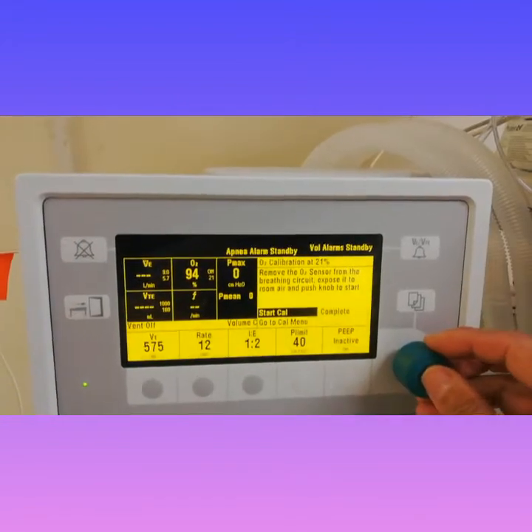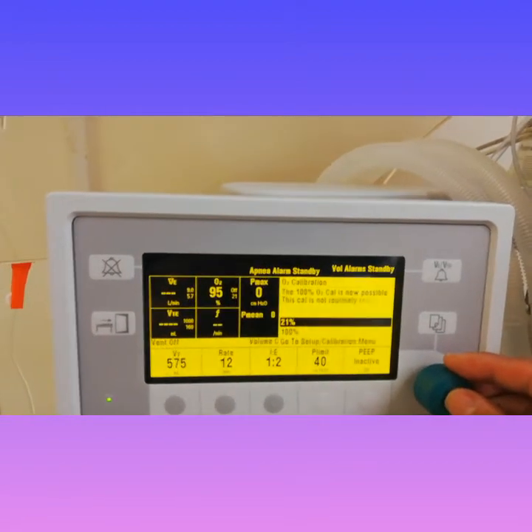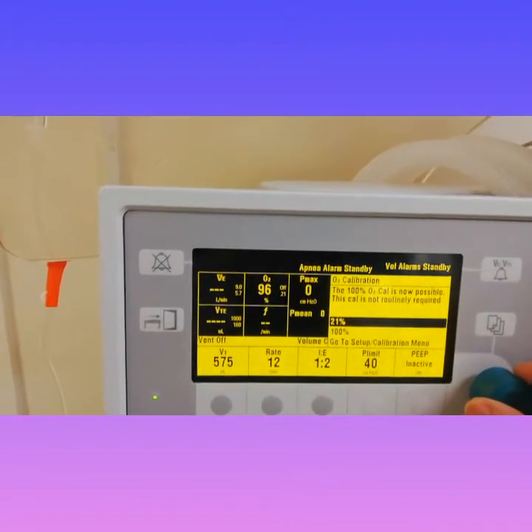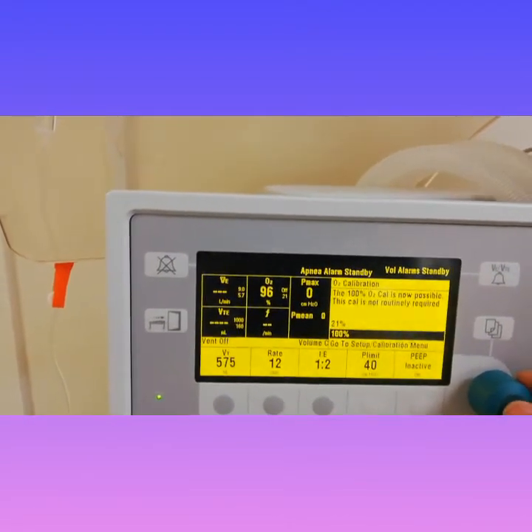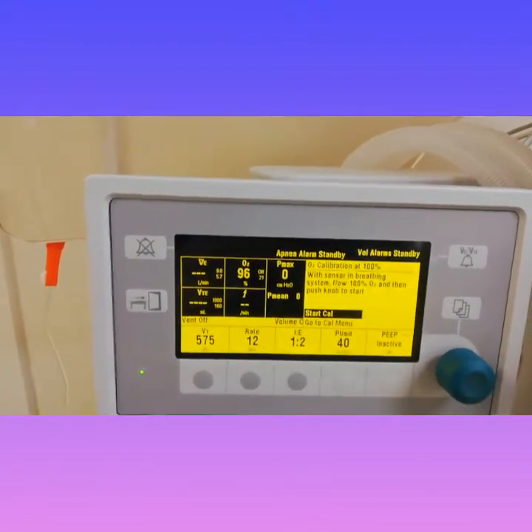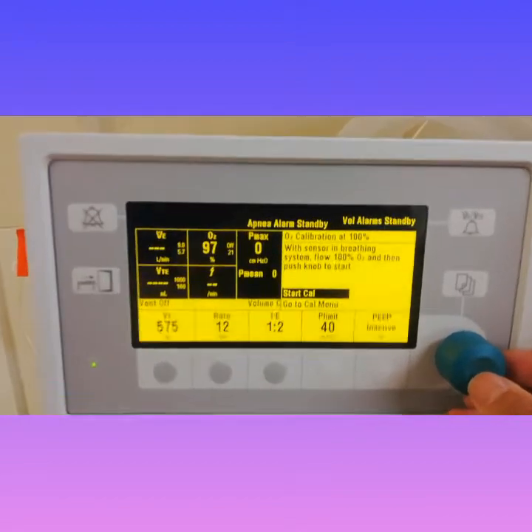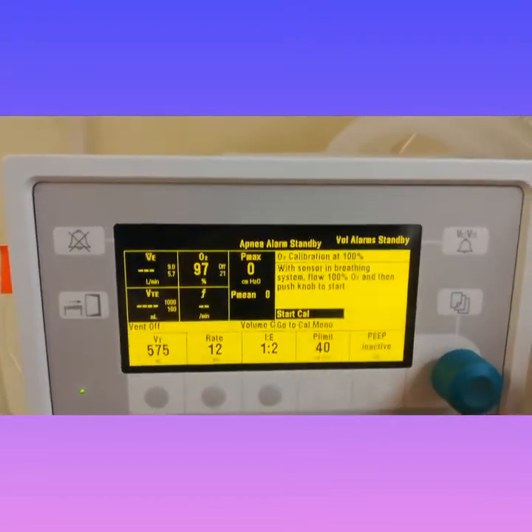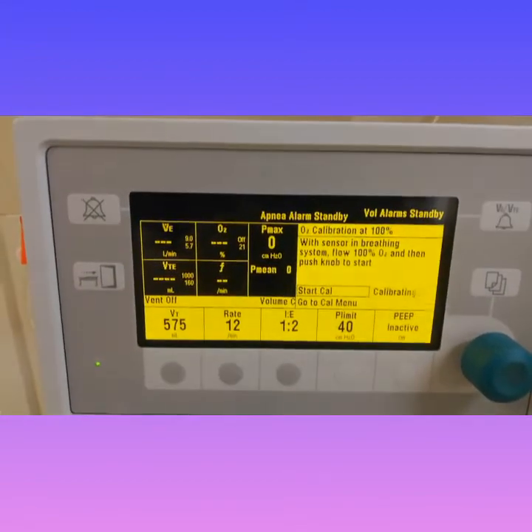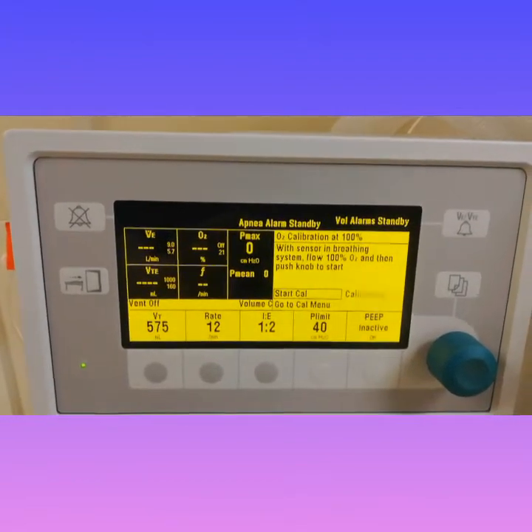Now moving on to the 100% calibration. The 100% calibration is not routinely required and it takes up to two minutes or so to calibrate at 100%. Start calibration — I was just calibrating the 100% here.